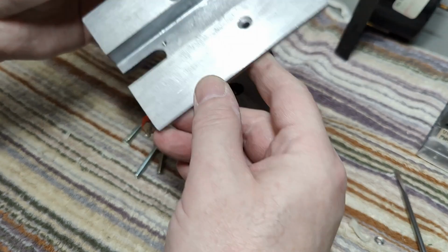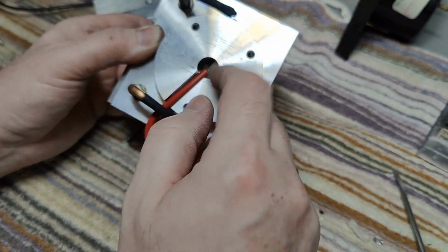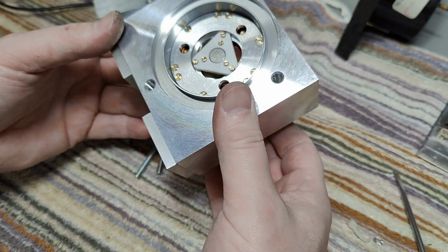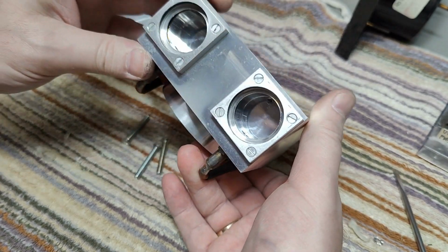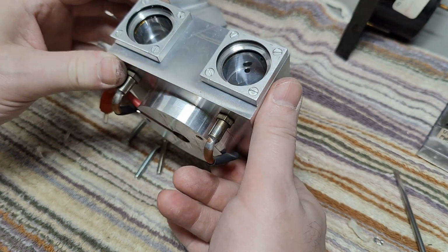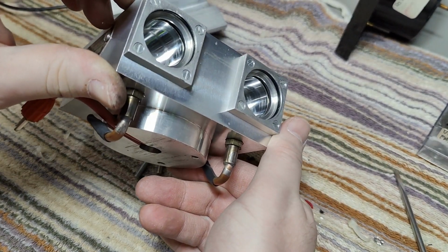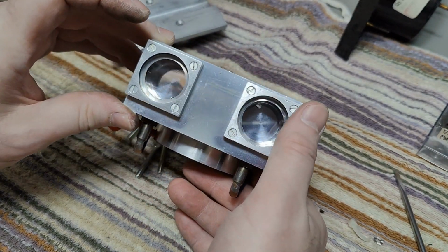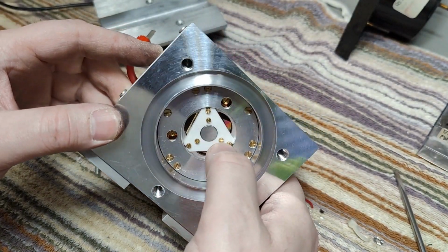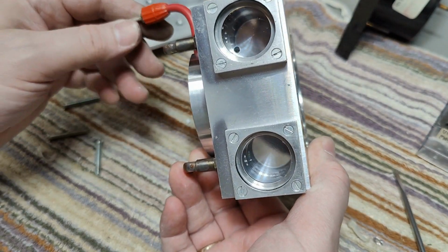And I need those for all sorts of things, so that was really a good find. Nice piece. So, of course, like I said, one more connection to the bottom side of that secret sensor and whatnot. I definitely want to go in here somehow. How? Oh, that feels like really thick glass. But what is going on in here? Is there a little nasty spring, or what is going on really?